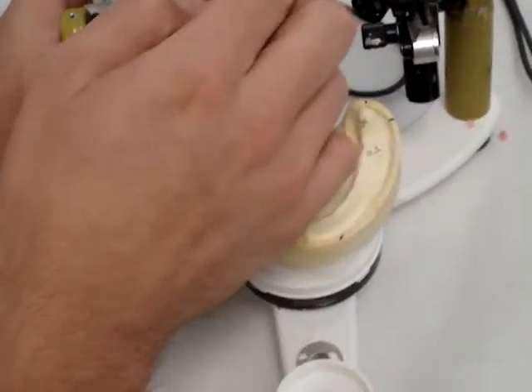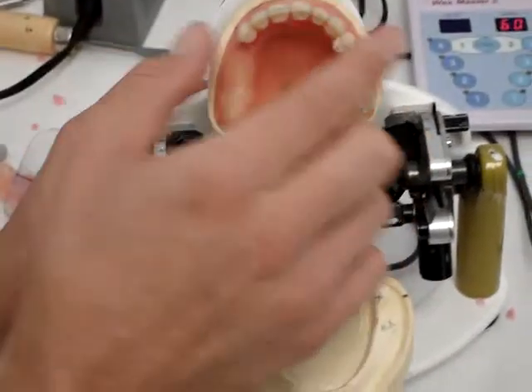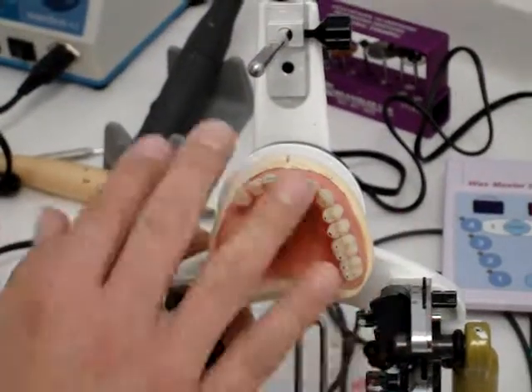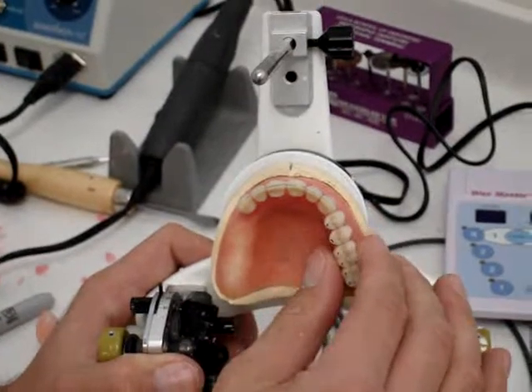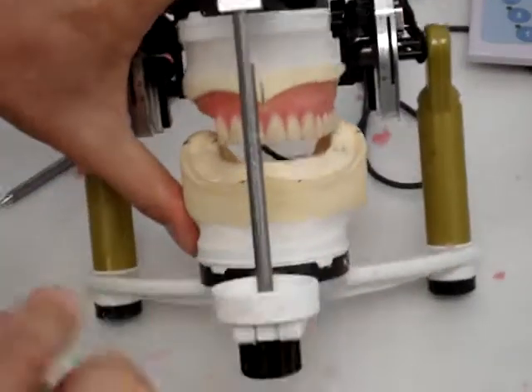Okay, and remember, normally we would set both teeth. I'd set both first premolars once, get them in the right position, then the seconds, then the first molars, and the second molars. So before we move on to the mandibular, we're going to set all these and get ready to go. One of the things you also want to do is check and make sure you have a nice even flow.